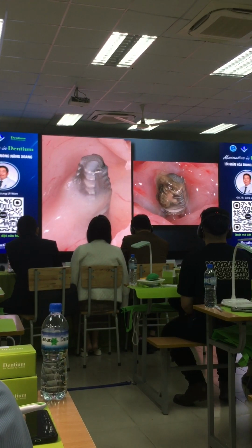These are clinical photographs from a dog experiment. Bacterial plaque can accumulate on the exposed implant surface in the sinus. To overcome these limitations, the use of bone graft materials is generally indicated in sinus augmentation.